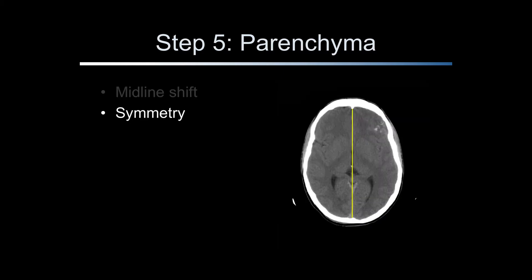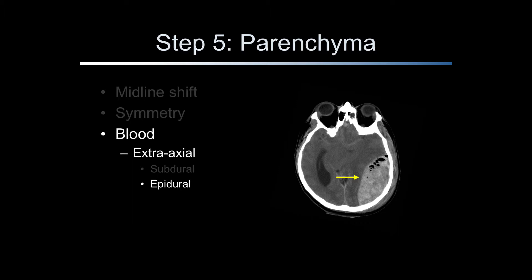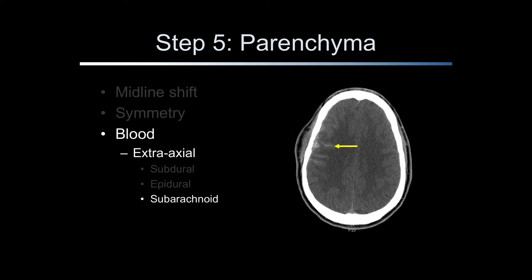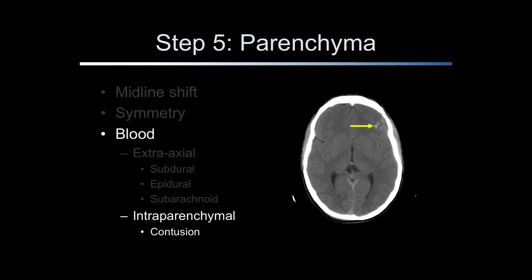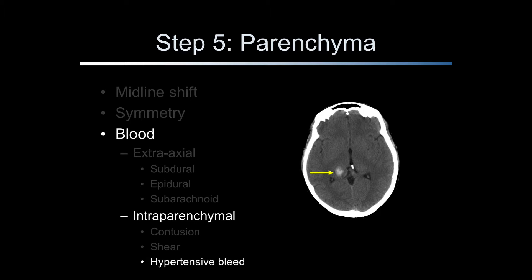Symmetry is defined as the correspondence in size, form, and arrangement of parts on opposite sides of a plane. Normal cerebral hemispheres should be fairly symmetric. Asymmetry suggests pathology or the patient may have their head tilted in the scanner. Blood in the head can be extra-axial, meaning it does not accumulate within but outside of the brain parenchyma, or intra-parenchymal, meaning the blood accumulates within the brain tissue itself. Extra-axial blood includes subdural bleeding, epidural bleeding, and subarachnoid blood, which can be traumatic or aneurysmal in origin. Blood can also be intra-parenchymal, which includes contusions, shear hemorrhage, bleeding from hypertension, tumor, infarction, or coagulopathy.